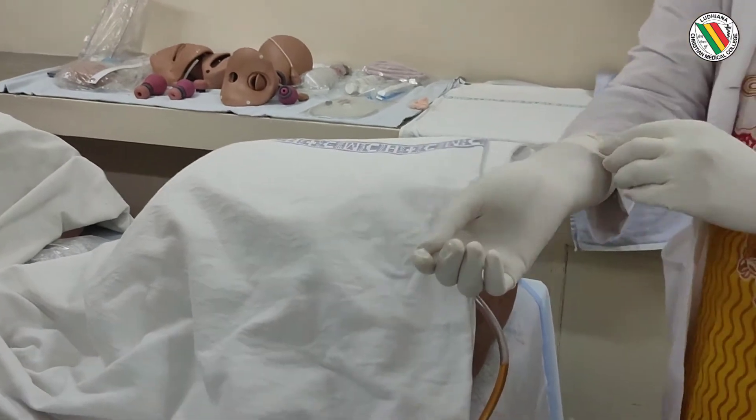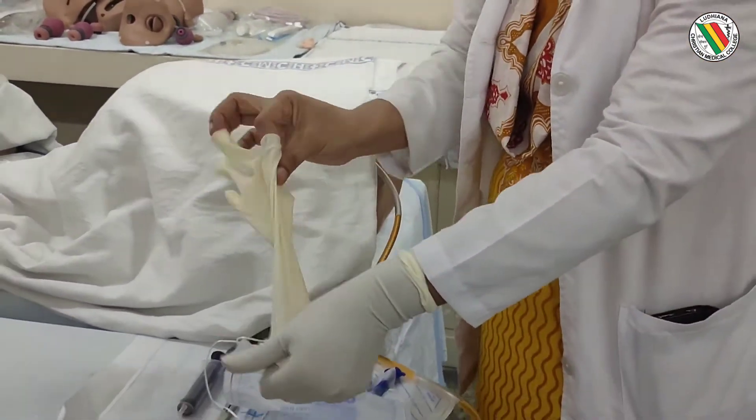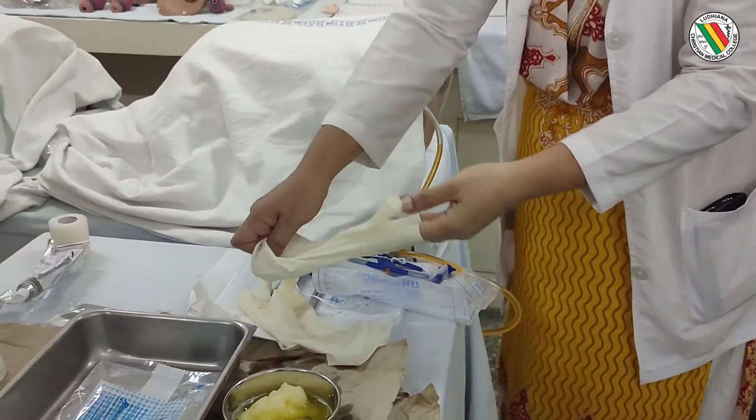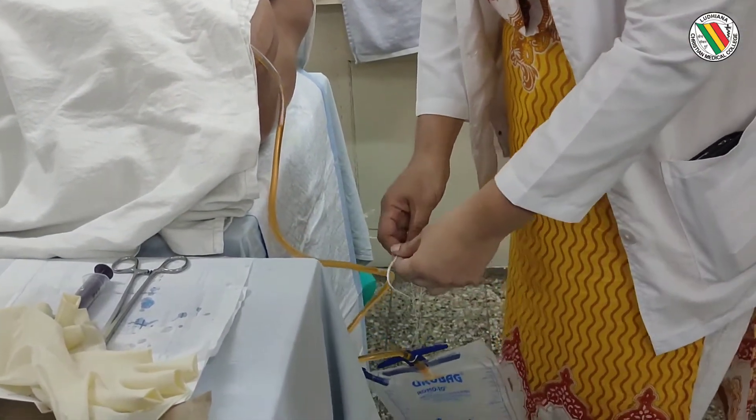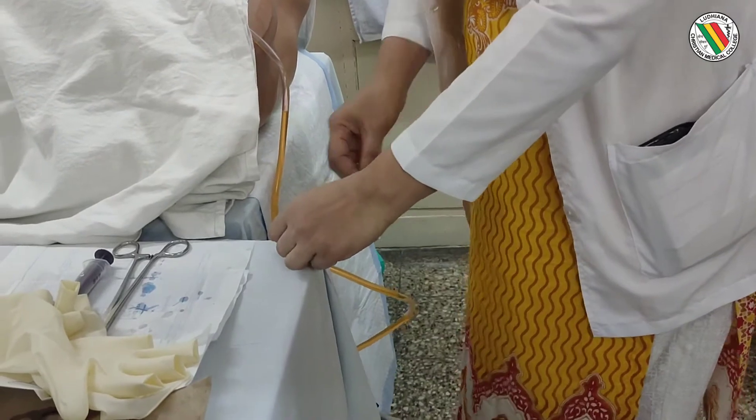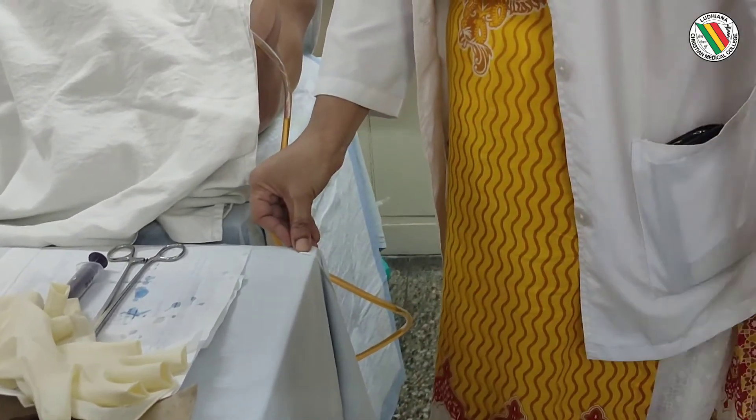Need to cover the patient and remove your gloves. All of this is done under sterile conditions. The urobag needs to be fixed to the bed frame. With that, we complete the steps of female catheterization.